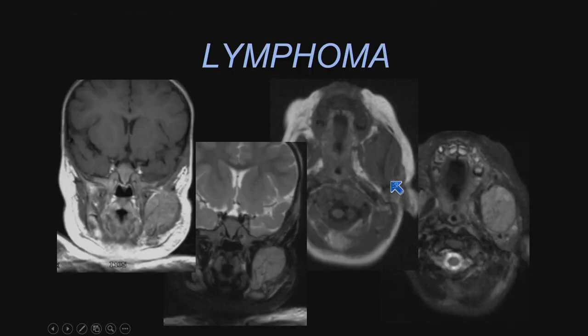Here's a patient with masticator space lymphoma. Because of the high nuclear-to-cytoplasmic ratio and the densely cellular nature of lymphoma, this will also restrict diffusion.